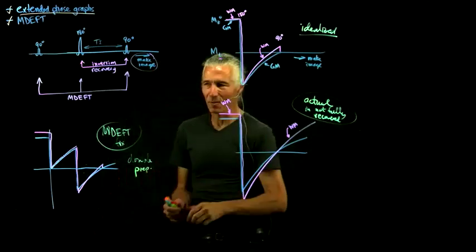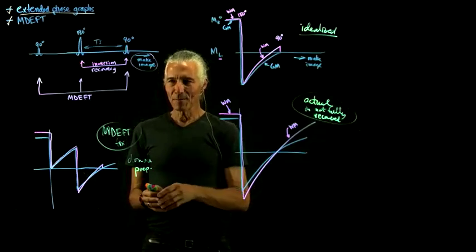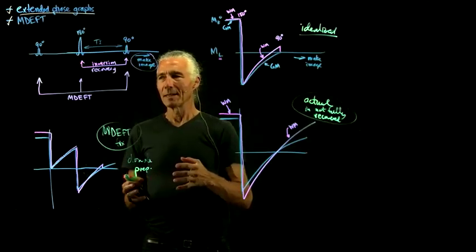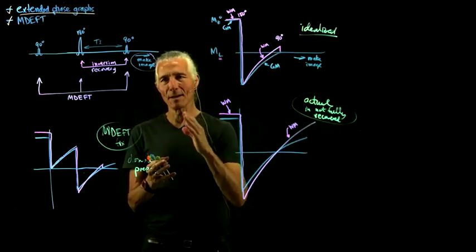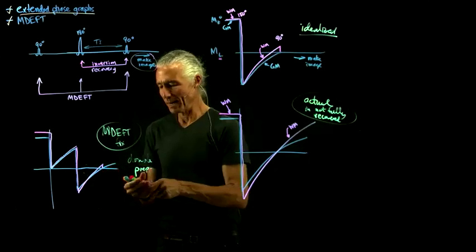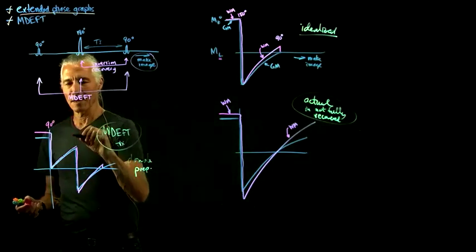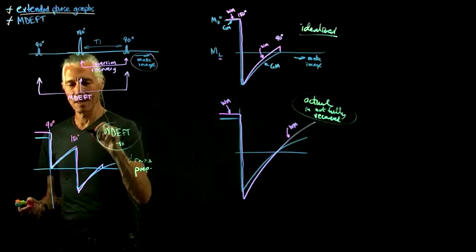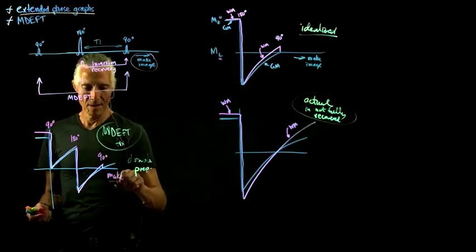And you could run Bloch equations and end up with an expression for what you would expect the brightness of a voxel to be given a given T1, a given time for the 90, and a given time for the 180. So this is our first 90, and then we do a 180, and then another 90 here, and then make the image.